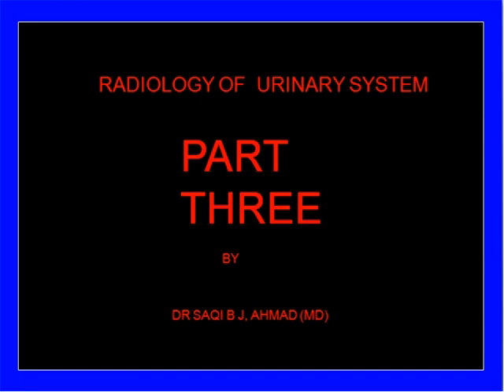As I said in the very first discussion of the radiology of the urinary system, there are so many conditions or diseases which can involve the urinary system. So we can divide this discussion into three parts. So far we have discussed part 1 and part 2, and today we are going to discuss all these conditions in part 3 of the radiology of the urinary system.